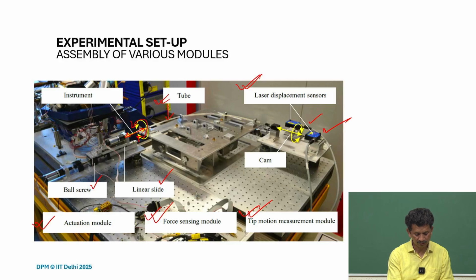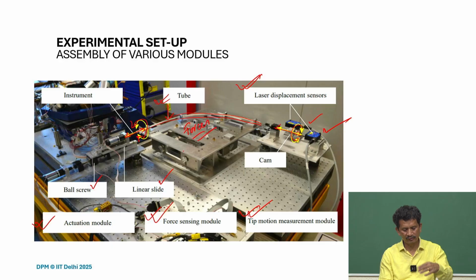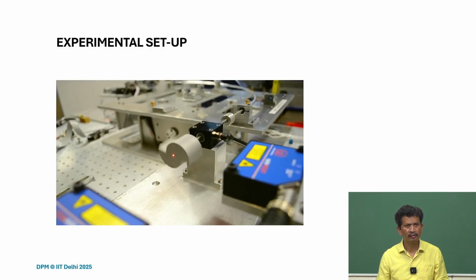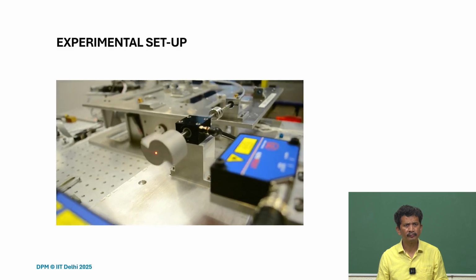And here the instrument is passing through this, and what's happening can be measured here. The tip motion can be measured, and all the forces. Actually, below, the 6-wire flexure and load cell is sitting, and it can measure and give us all the forces of interaction.